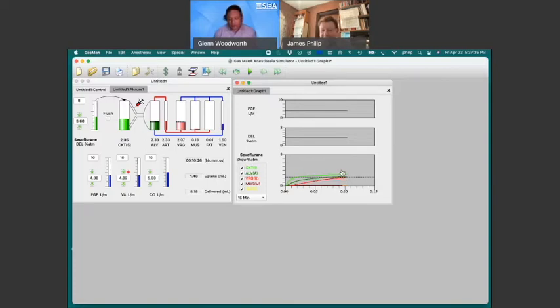So if I were to summarize, part of this is a simulator where you can vary all different kinds of variables. So let's say I could manipulate the inspired sevoflurane concentration, and I could see how long it would take for the vessel-rich group in the brain to reach 1 MAC. That would be an example of being able to manipulate variables just to see what would happen.